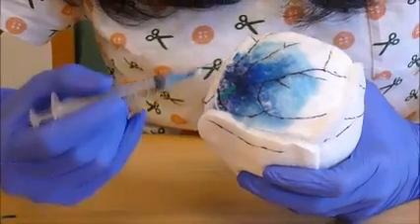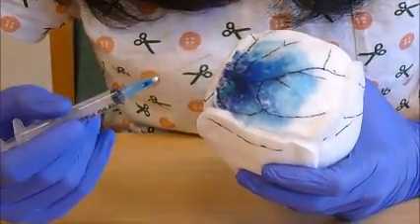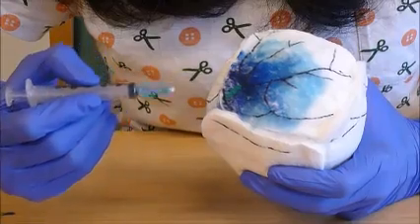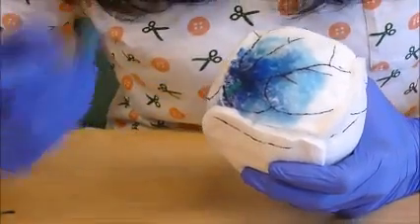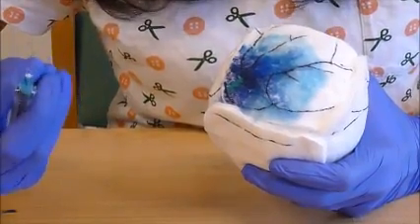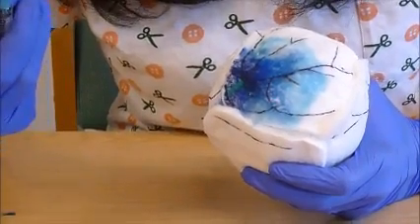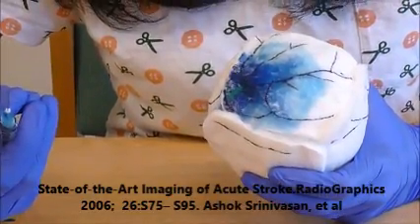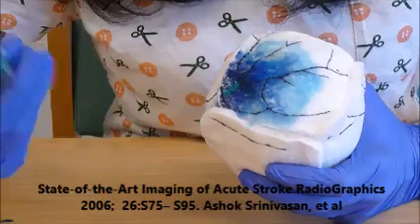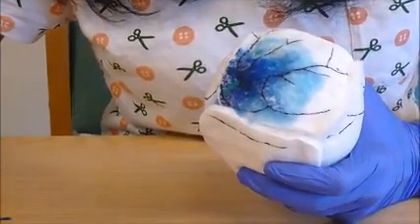MR diffusion imaging is based on diffusion and Brownian movement of water molecules. In this area, the dye is restricted to the area of necrosis; water molecules are restricted to the area of necrosis because of accumulation and edema. There is a restricted Brownian movement of those molecules. Hence, there is less loss of signal on MR imaging, leading to a brighter spot on MR diffusion scans.